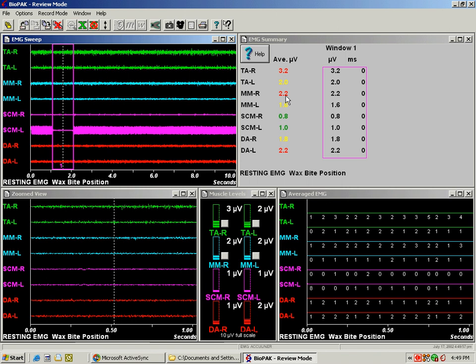And the temporalis right, masseter right, and digastric left are all considered by this clinician to be hyperactive, in other words over 2 microvolts.